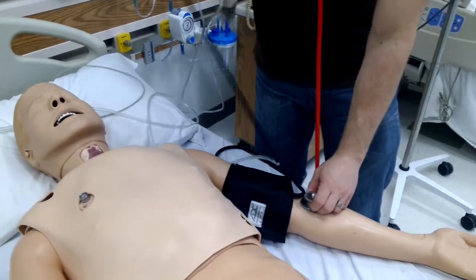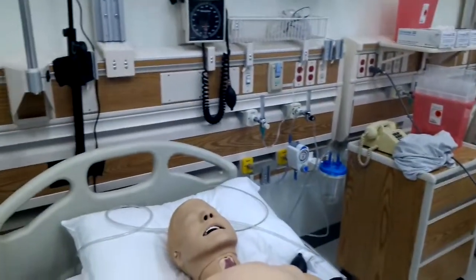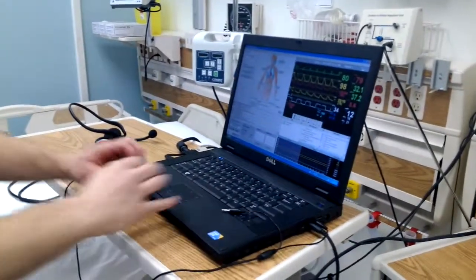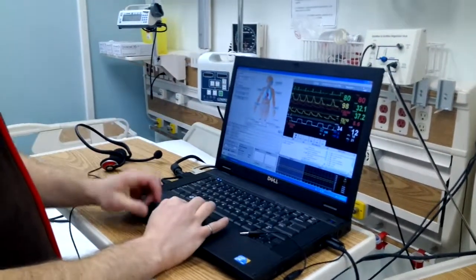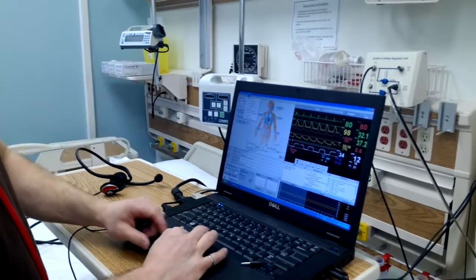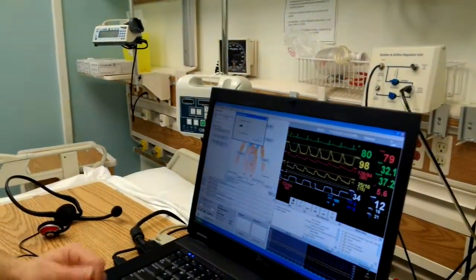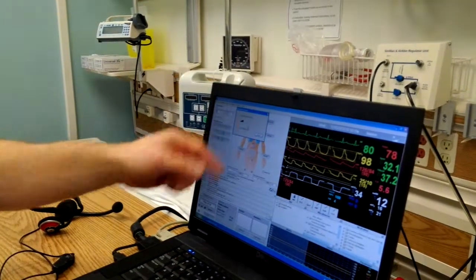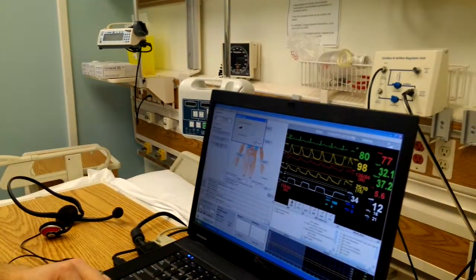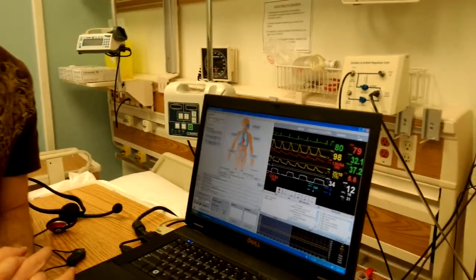Then we pump up, we release, and you'll hear it. We can go to the mannequin's control laptop. For the Korotkoff sounds, we have to go to the edit menu. Down at the bottom, we have Korotkoff controls and Korotkoff sound volume. Its default is in the middle at 5; we can put it up to 9 or anywhere in between. Close, and the volume will be adjusted for those BP sounds.